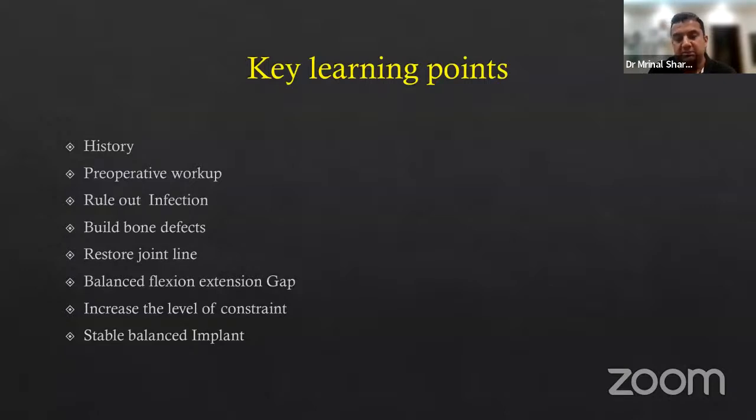You will always need to increase the level of constraint one level up, like from a PS to a valgus varus constraint or to a hinge. And then you might get a balanced, stable implant for longevity. Thank you.